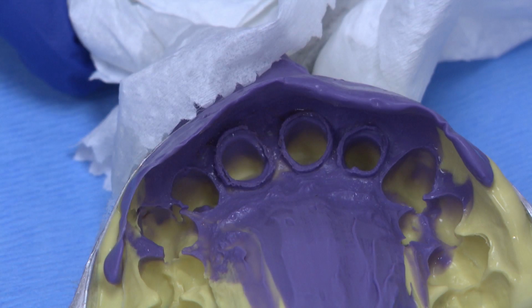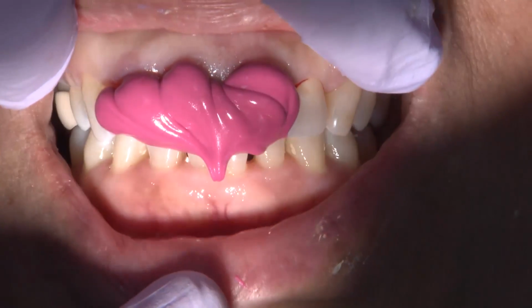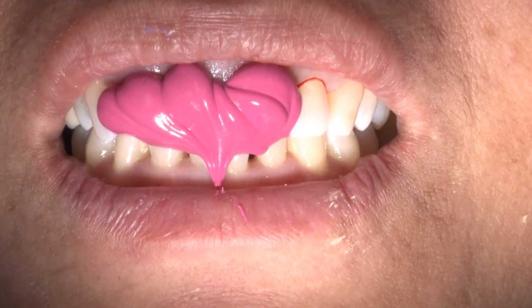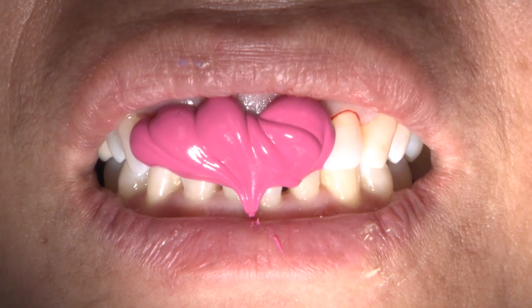After I guide the patient into centric closed position, my assistant makes sure the patient stays there during the full setting time. If the patient has failed to close all the way, but the impression of the working and opposing sides are satisfactory, we can still use the impression if a separate occlusal registration is taken. When that happens, we instruct the technician to mount the models with the registered bite.